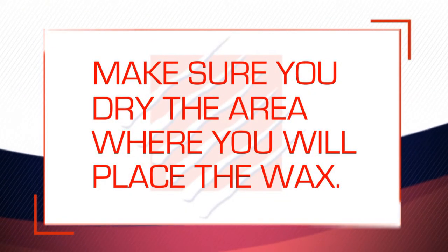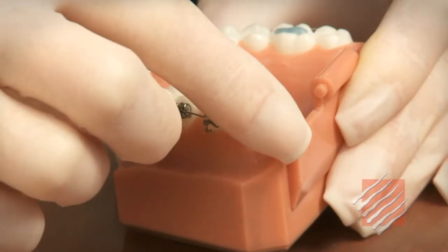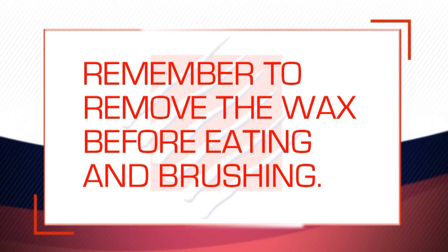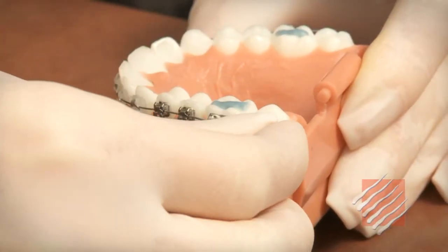Make sure to dry the area where you're going to be placing the wax. Then just push the wax onto the area like this and leave it there. Obviously, you'll want to remove the wax before eating and before you brush, and to do that, just lift it out gently with your fingernail.